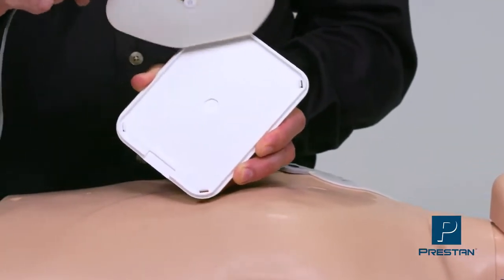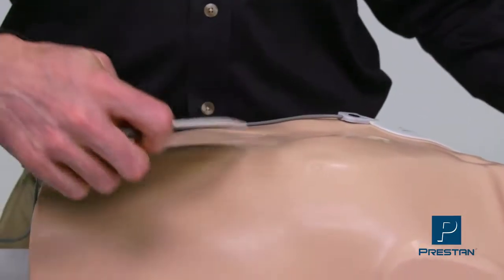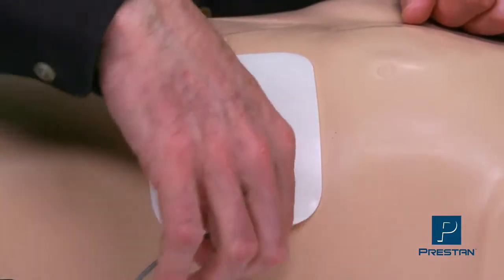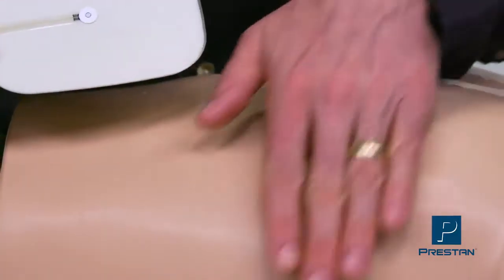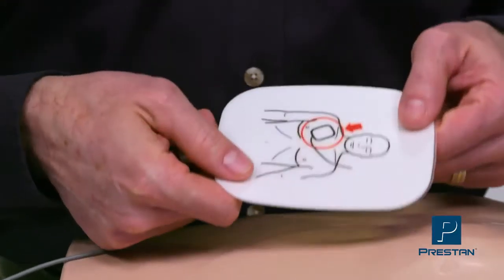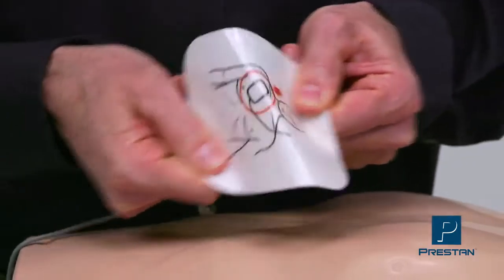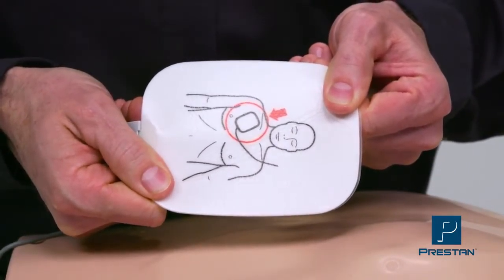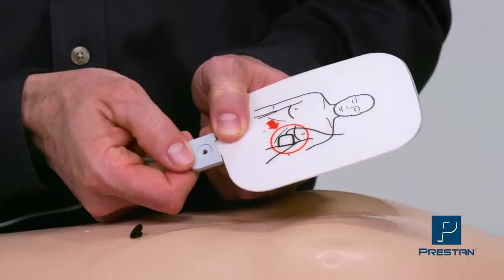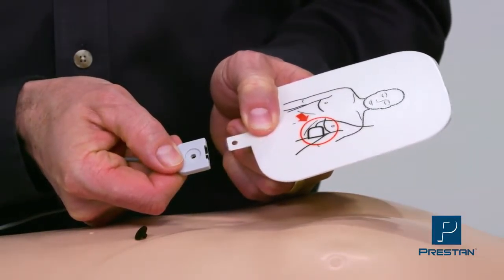The pads adhere to any mannequin on the market and the adhesive does not leave behind a sticky residue. No more damaged pads or cleaning off adhesive from your mannequins — no more frustration. The pads are durable, lasting up to a hundred applications, and replacement is easy and affordable. Replace only the pad and not the cord.